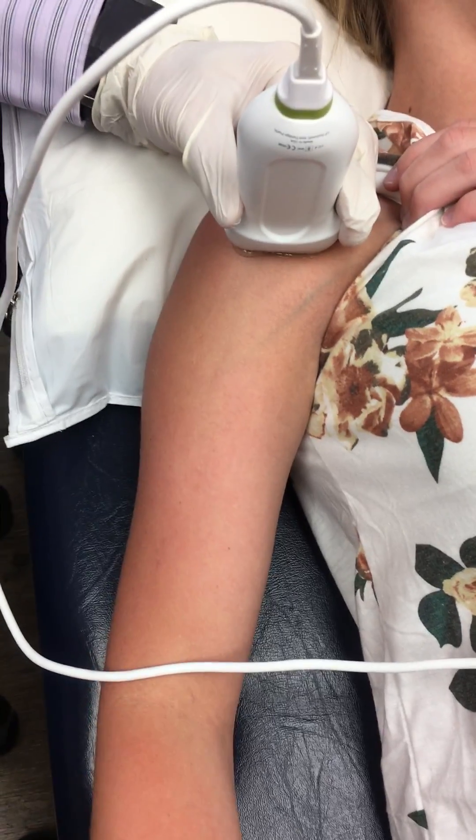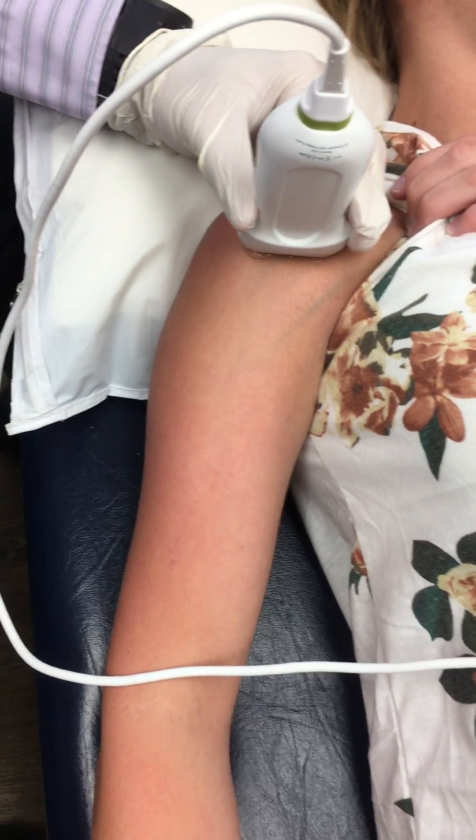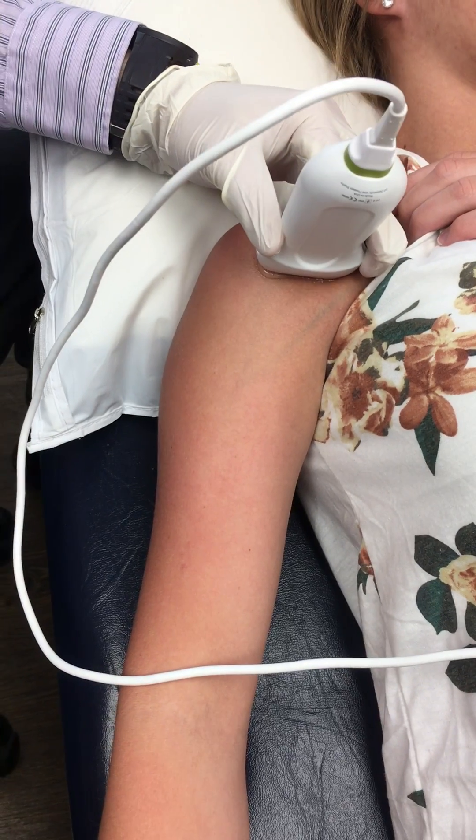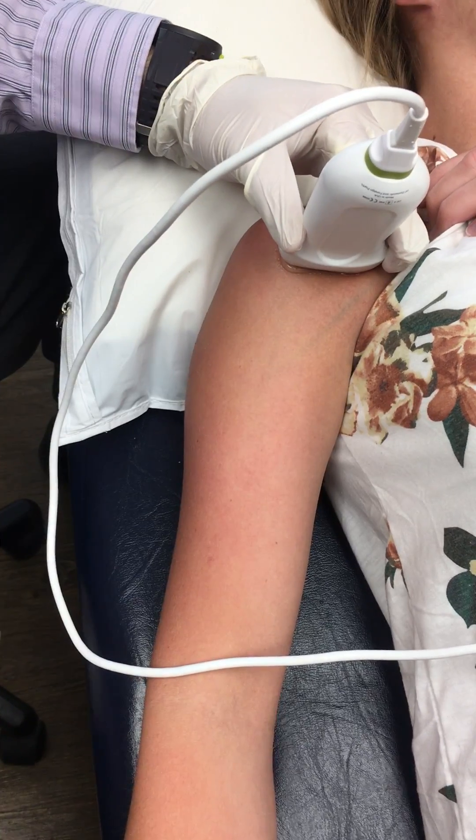I'm actually gonna roll in just a touch about like that. I'll have you just hold your arm just like that — that's perfect. And you can see the bicep tendon there on the machine.